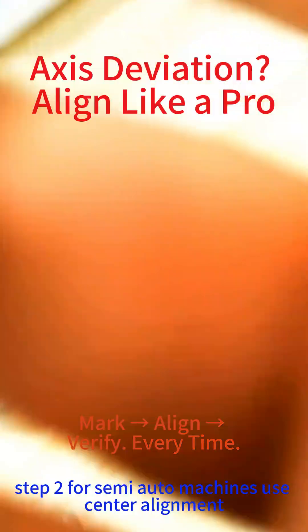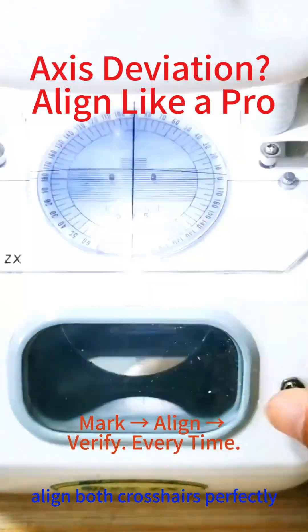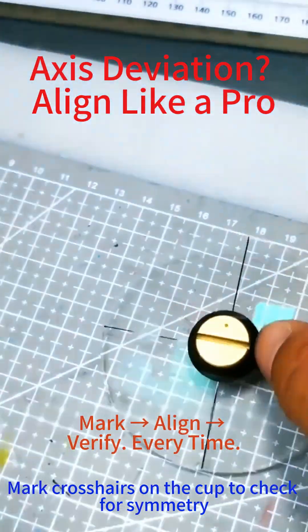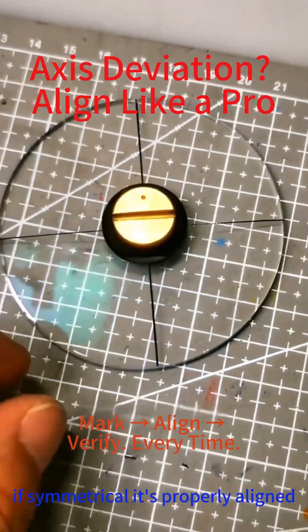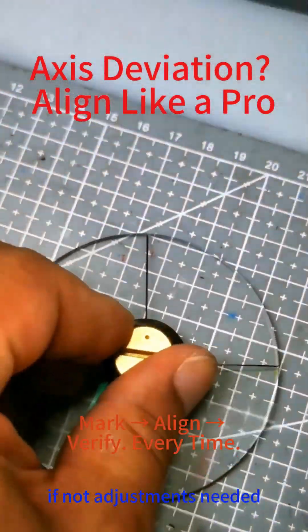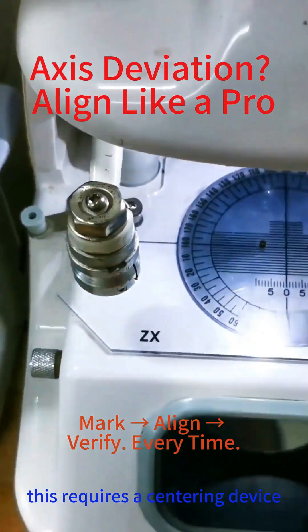Step 2: For semi-auto machines, use center alignment — adjust the settings, then align both crosshairs perfectly. Attach the suction cup and mark crosshairs on the cup too, checking for symmetry. If symmetrical, it's properly aligned; if not, adjustments are needed. Tweak the setup until precise. This requires a centering device.